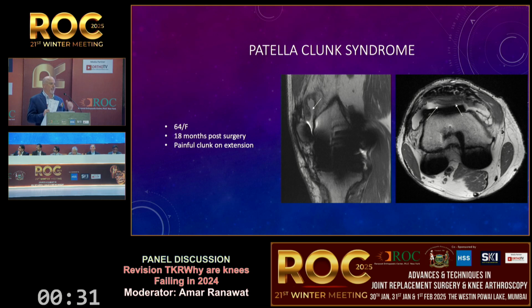So as I was saying, there is a list that is out there, and loosening is number 2. But I think if you get good, proper cement technique, regardless of how accurate your bone cuts are, early loosening should be a very, very rare thing, right? And most of these surgical problems can be avoided with proper training and technique.